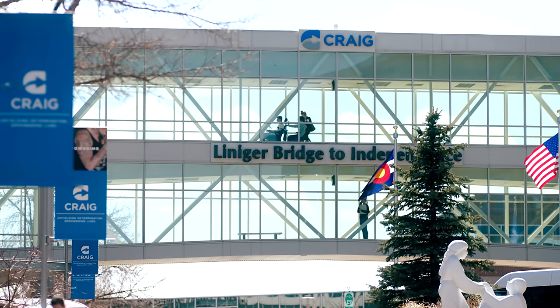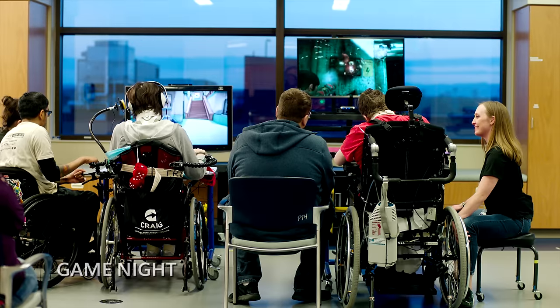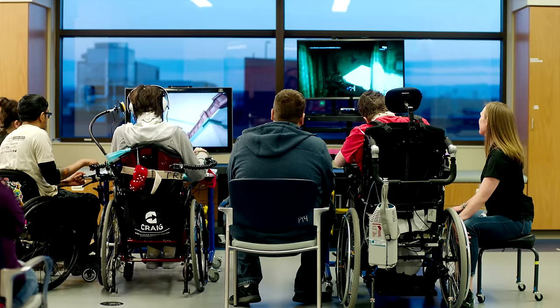Craig Hospital is a facility for patients who've either had a spinal cord injury or a traumatic brain injury, and it's a place for their rehab. We're here for game night, and we're helping new patients getting back into gaming again.